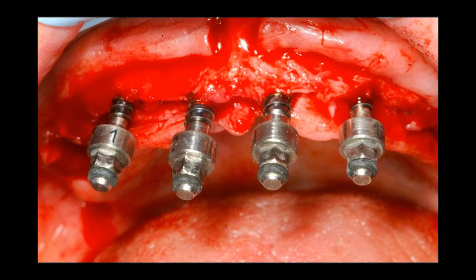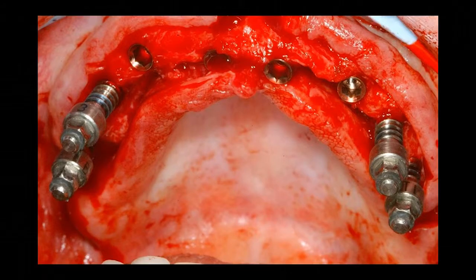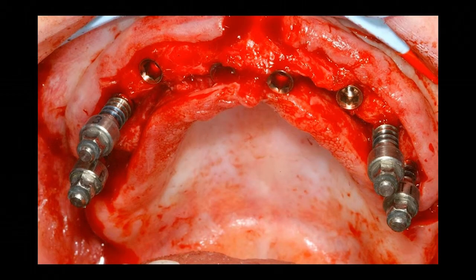So we already talked about peri-implantitis. If you drive through Maurice, Louisiana, there's a guy, I forgot his name, but he's going to give you a ticket. Port Barre, Maurice, Raceland, those are the places where if you drive too fast, you're going to get pulled over. Well, this guy sits in his car and smokes 3 or 4 packs of cigarettes a day. This is a nice-looking case, and he comes in one day, and take a look at that. I mean, it's a perfect storm. He doesn't clean it. He smokes. It's a disaster.